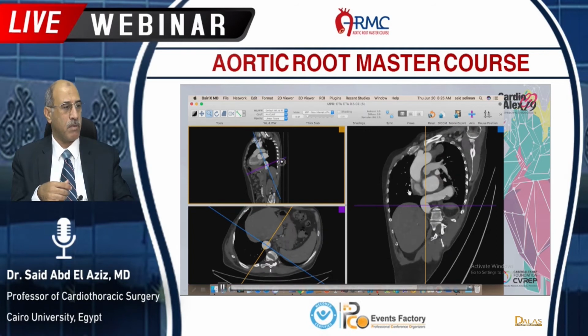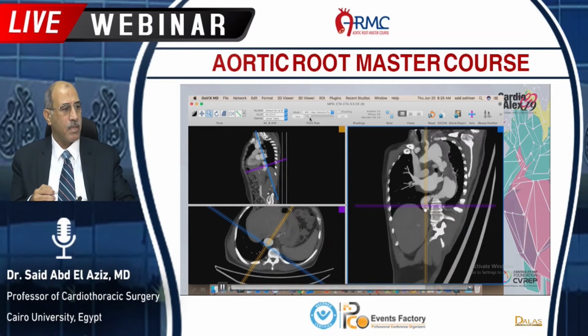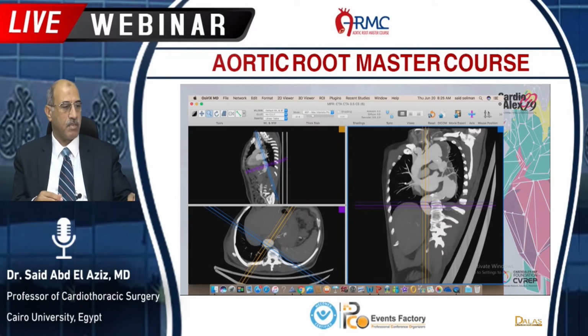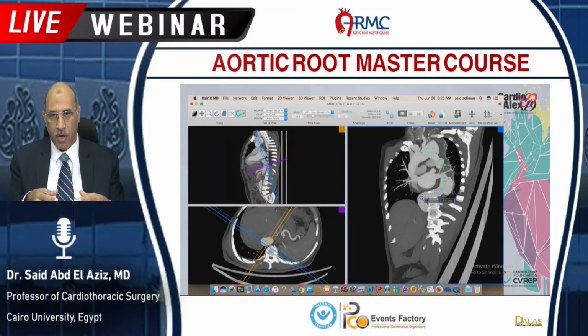In that patient on the video, I think we will need to cover from the carotid artery till the descending thoracic aorta just above the diaphragm. So I think we will need to cover more than 30 centimeters. And this is sizing. It comes with practice. You cannot learn it from a video, but we have to practice and have CT scans and put them on the computer and do measurements, and you can measure wrongly and then correct yourself and so on.